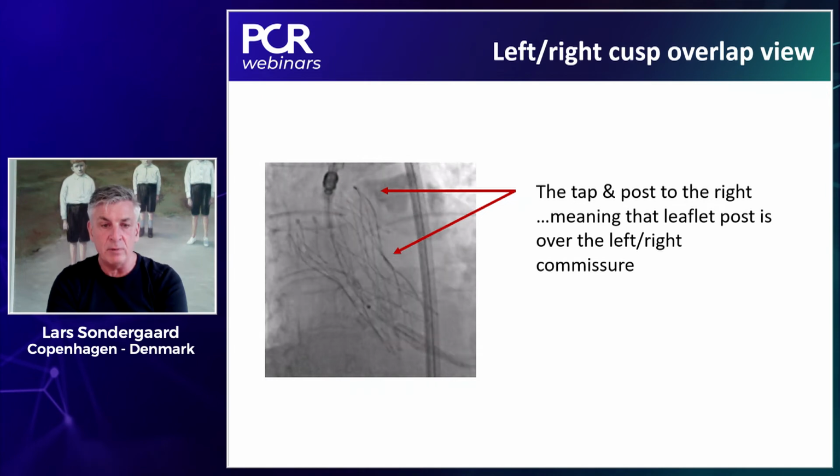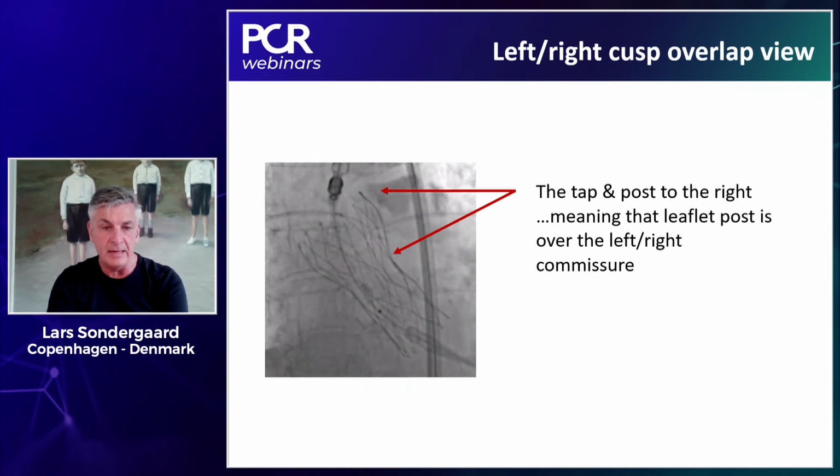What kind of guide wire are you using when you implant the valve? What kind of stiff guide wire? Yeah, I think that's a good question, because there's a lot of variability amongst operators and even amongst different countries. I used to use different guide wires for each valve once upon a time, and now I've just simplified it. I use Safari for every valve. I think it's reliable. I like the pre-shaped curve. It gives me the right amount of stiffness, and I think it's very safe.